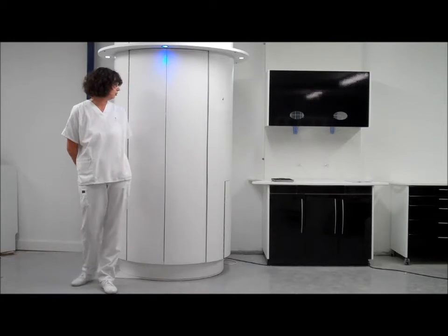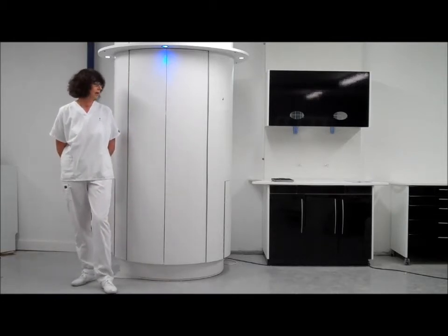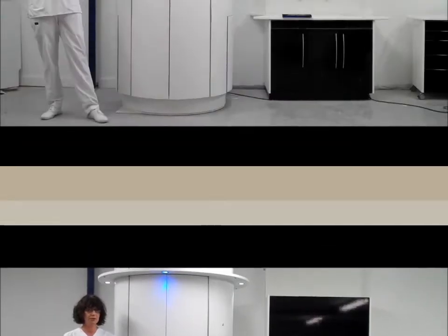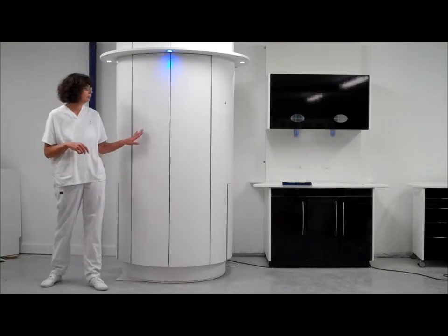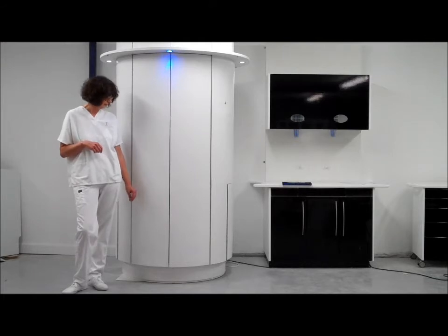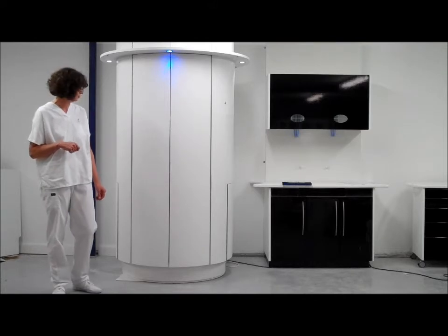The decon pod is a prefabricated sterilisation room which houses all your requirements within the space of 1.2m². The decon pod is fabricated from a solid surface material making it bacteriostatic. It is a sleek clinical design that wouldn't look out of place in any surgery.